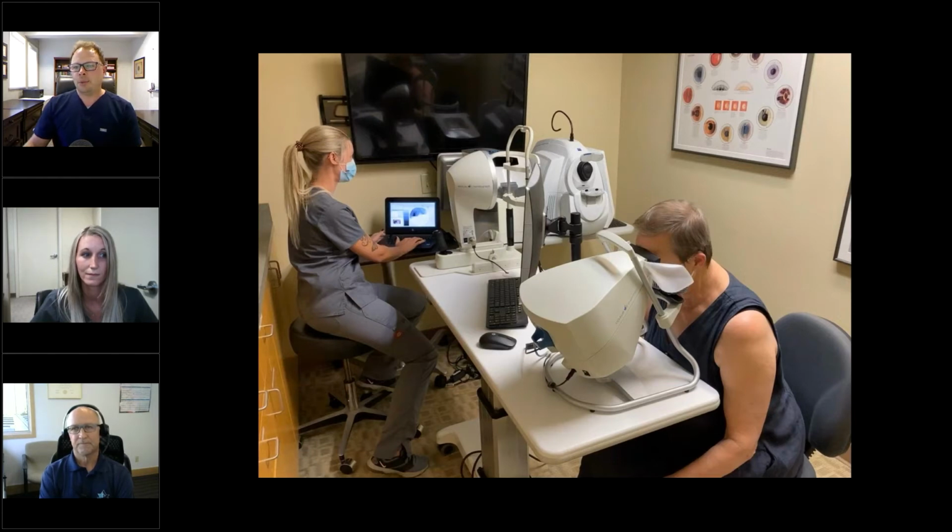I prepared some case examples if you guys would be interested in seeing those. I didn't really do them like an academic case presentation. Mostly I wanted to work through it as if I'm doing on-demand perimetry. The Smartfield can print out a paper print that looks a lot like what some people would be used to with the Humphrey. So when I walk in the room, I have that already, but it's also up on a computer screen. So I wanted to spend just a few minutes showing the differences between the paper printout, which is kind of like your old flip phone back in the 90s, versus the computer version where you can smartphone it up. It's pretty impressive technology. So if it's okay with you guys, I'll jump into that unless there's anything to add.